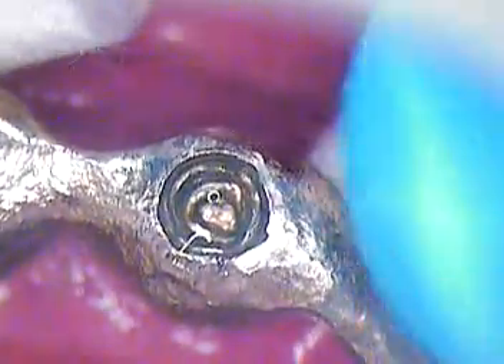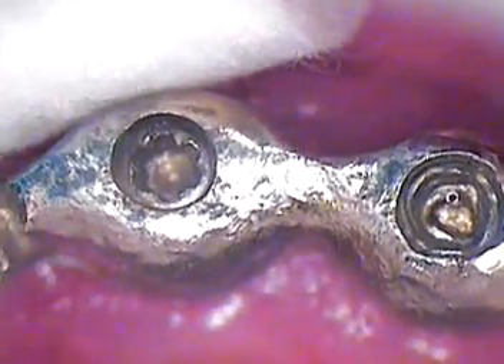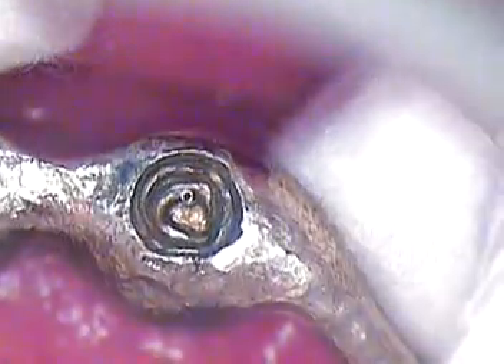Hello, this is Dr. Jerry Cuomo. I'm here in my Boca Raton office filming a live repair case where we're going to take out a Strahmann occlusal screw that has been referred to me. As you notice, both screws here — one has a star configuration, the other one does not.